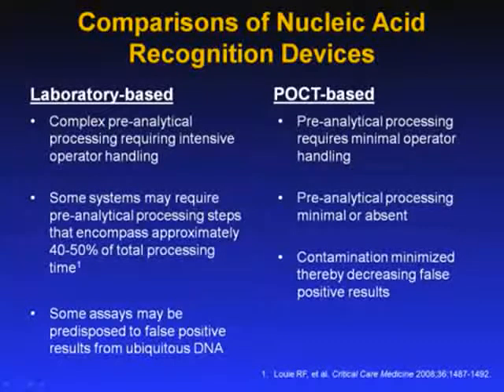In addition, DNA is effectively on every surface and any solution in our environment. This may pose as a source of contamination for nucleic acid recognition devices during the tedious hands-on steps previously mentioned. I also mentioned earlier that some multiplex detection capabilities may be hampered by DNA contamination. To assist in solving this problem with PCR, for example, Roche developed molecular-grade or M-grade DNA-free products where the DNA fragments are so small so as not to cause background noise and threshold detection by the device.